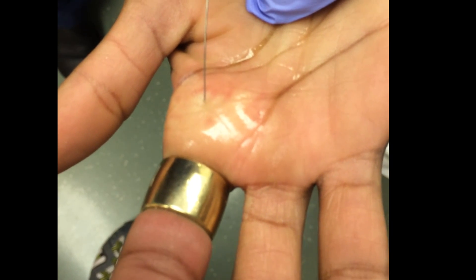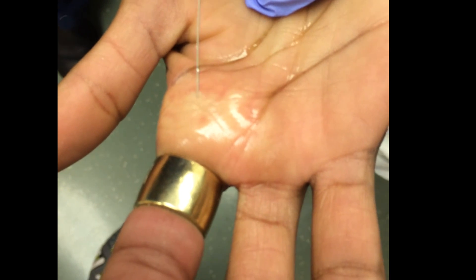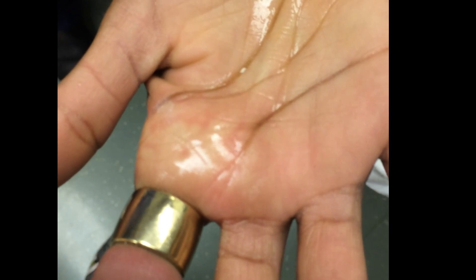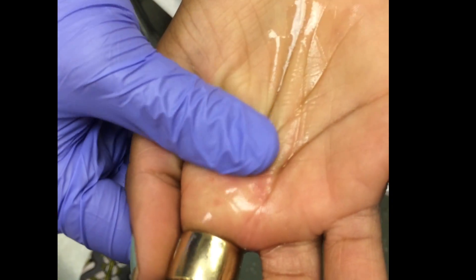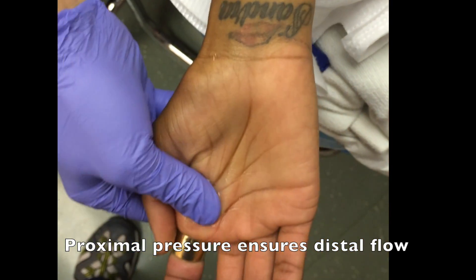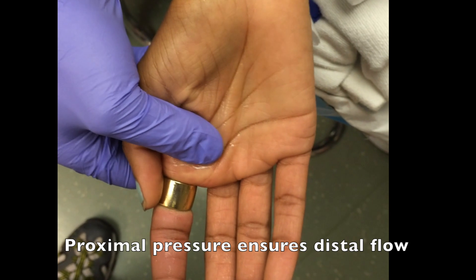You'll notice that both patients used in these examples had tight rings around their fingers. In fact, stuck rings were the reason for the use of transthecal digital nerve block in these situations to facilitate removal of the rings. The final step is to apply proximal pressure at the site of injection to ensure distal flow of the anesthetic.